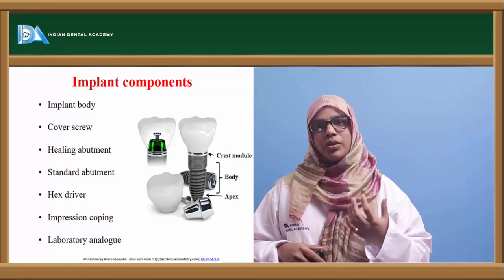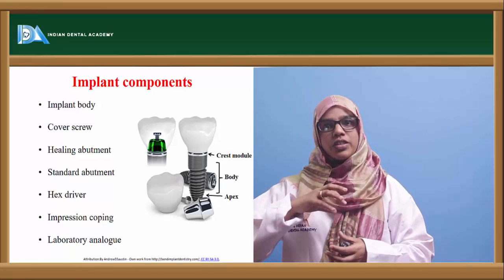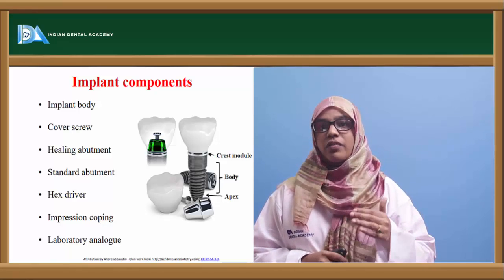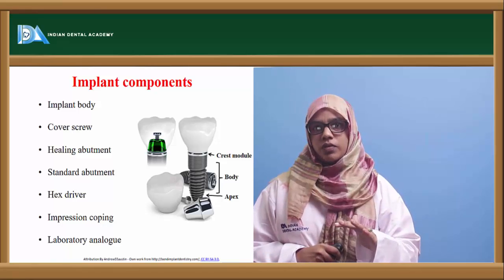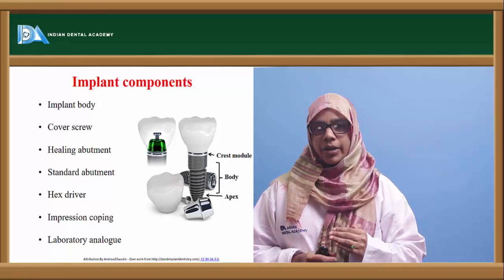They say that as you increase the crestal module, the stability increases, because on top of this implant, you're going to fix a cover screw, you're going to fix a healing abutment. So, the more you increase the height, the better it is, they say. Then you have a cover screw. Now, the cover screw is used to cover the occlusal surface of the implant to prevent the overgrowth or the ingrowth of the soft tissue.